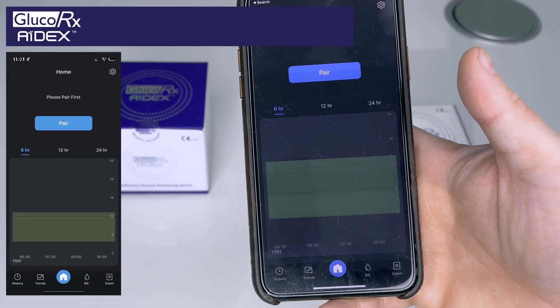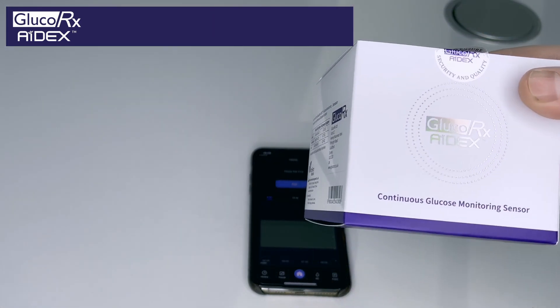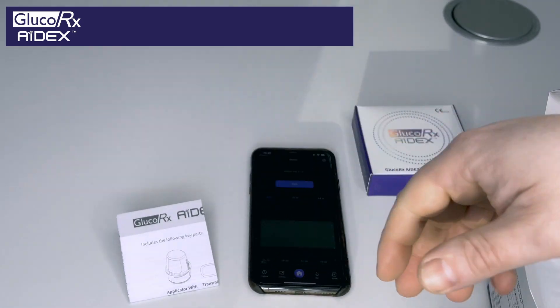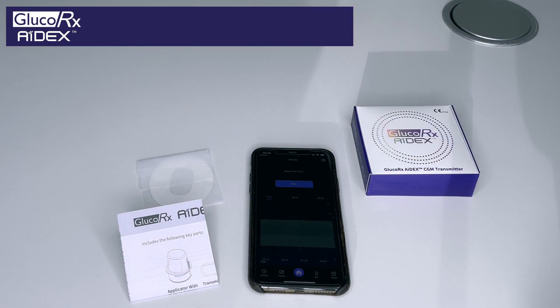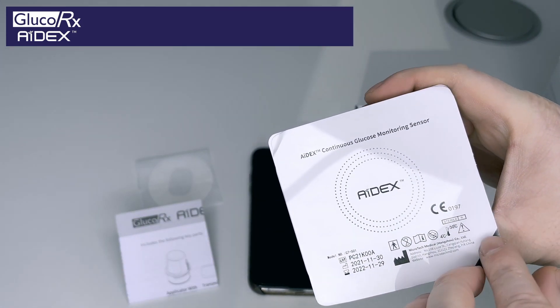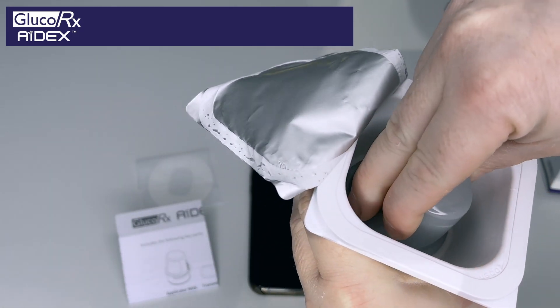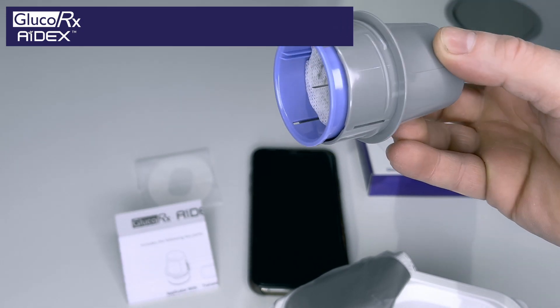It's asking me to pair a new transmitter and a new sensor. Starting with the sensor — the box includes instructions, an overpatch, and then the sensor. With the sensor, peel and then to open, you simply twist anti-clockwise. That's now the sensor out, ready to be applied.